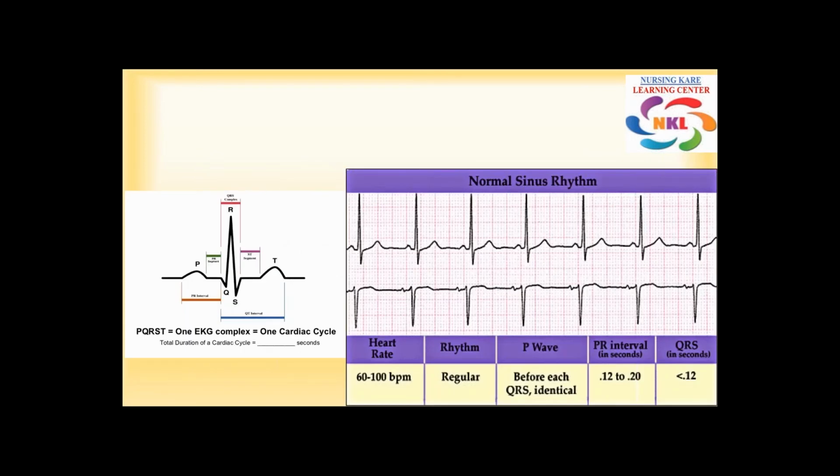So in terms of the normal sinus rhythm, the word sinus tells us that the beat is coming from the SA node. Any beat that comes from the heart and is initiated by the SA node is called a sinus rhythm. There are a couple of things they look at when identifying if it is a normal rhythm or not. Not only are they looking at the contraction and the relaxation, but they're looking at the length. For example, normal heart rate is 60 to 100. And the SA node, because it is the pacemaker, that's the rate of the SA node, from 60 to 100.